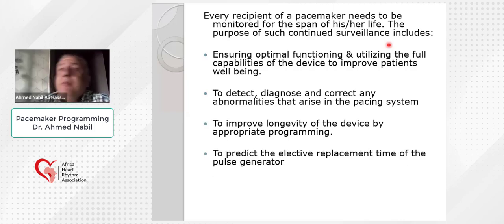When the pacemaker starts to reach the end of life, or the elective replacement time at which the battery is depleted, it is very important to detect this situation, to replace the battery before it totally reaches the end of life and before the patient has a dysfunction or problem in his pacemaker.